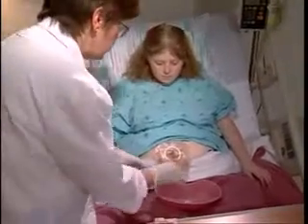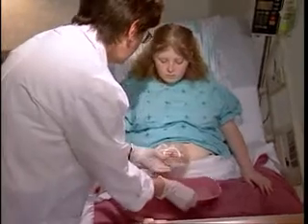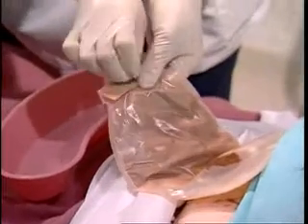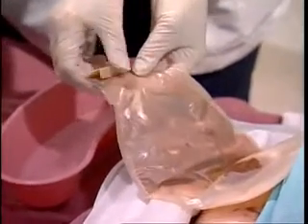While in the hospital, the nurse may have you empty your pouch into a container rather than the toilet. To empty your pouch, begin by holding up the end of the pouch, then open the Velcro closure or unfasten the clamp. If using a pouch with a clamp, you can fold up or cuff the end of the pouch to help keep the opening clean.